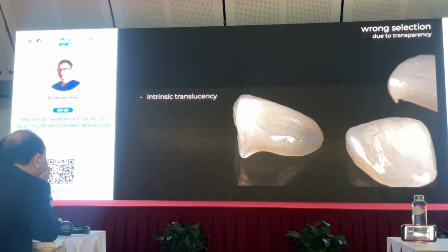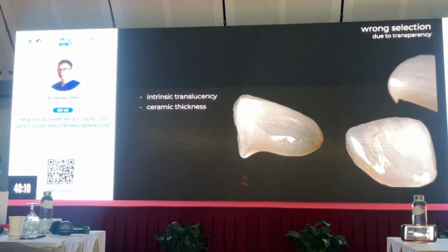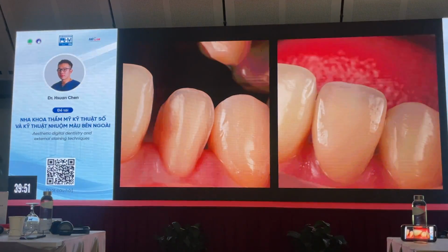That's why some ceramics like Emax have HT, MT, LT, high translucency, medium translucency, low translucency. So its internal translucency will also affect it. It's also affected by the thickness. So if you are doing very thin veneers, it's going to change the color. It's also affected by the stump color. So if you choose the A1 block, because you gave the lab technician the A1 shade tab, you're going to make the wrong choice. It's going to become too dark, right?